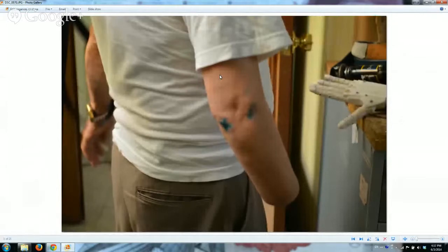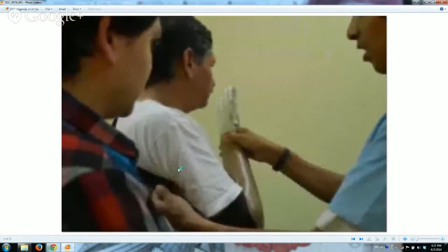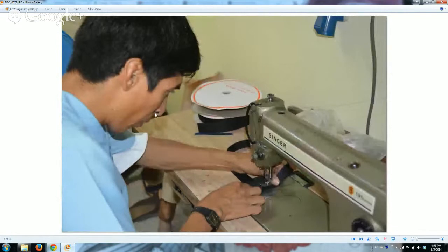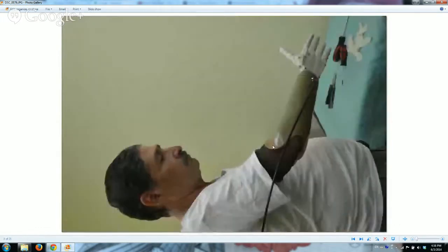So this is the patient — he's an ex-soldier in Guatemala. We spoke with various people working on prosthetics here in Guatemala, and they recommended we shouldn't start with children since we weren't very sure of the technology. That's why they recommended someone from the Army. This ex-soldier lost his arm in combat and has been a prosthetic user for around 20 years — he knows what to expect. We're also working with a prosthetist from the Army who's helping us take measurements and adapt the hand.